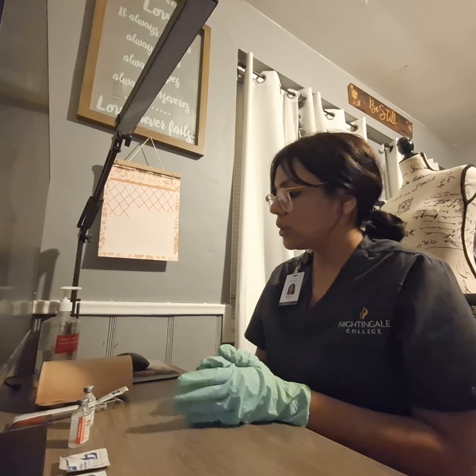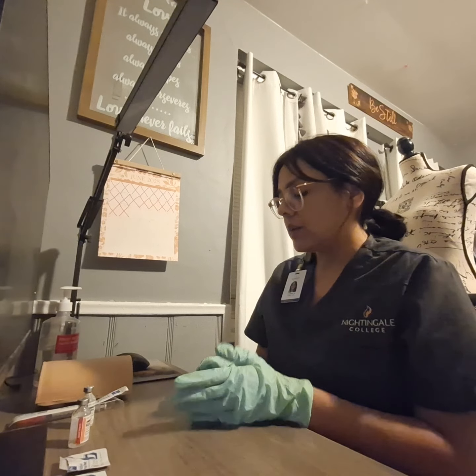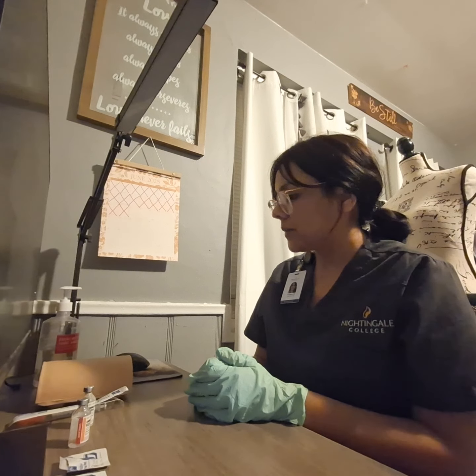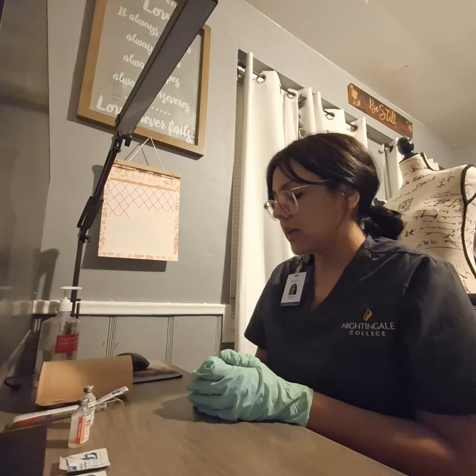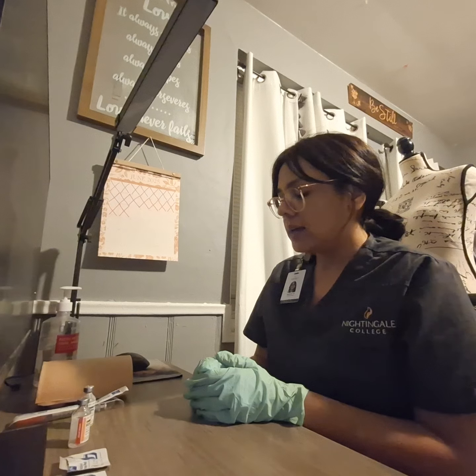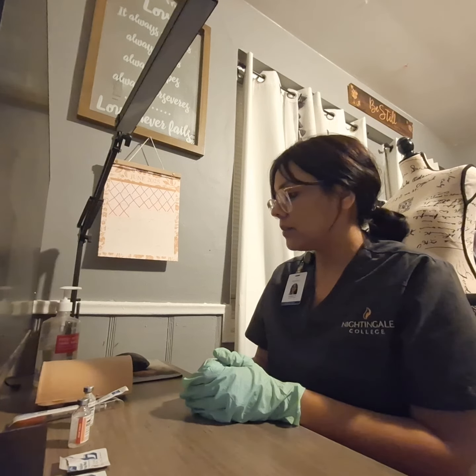So we went ahead and checked your blood glucose level. It's 130, and now we're gonna go ahead and grab that insulin. And so 30 minutes after the insulin administration, you can eat. So I'll go ahead and bring you your breakfast. Okay. So I'll go ahead and verify the doctor's order in the MAR, and I'll make sure to verify the medications that I have pulled against the MAR.